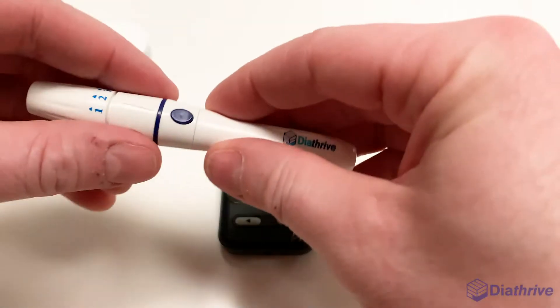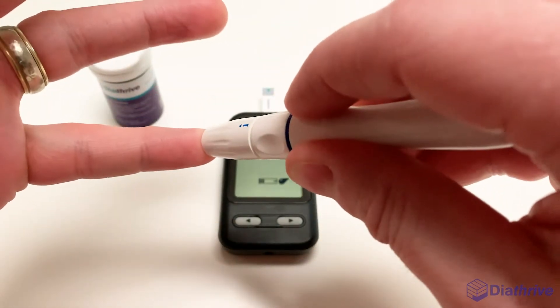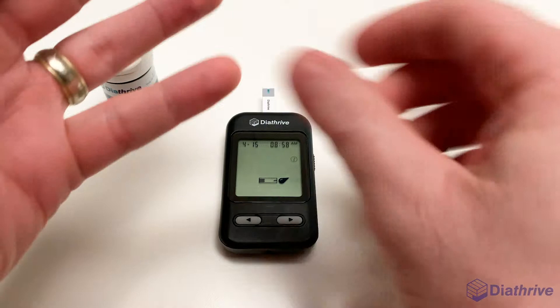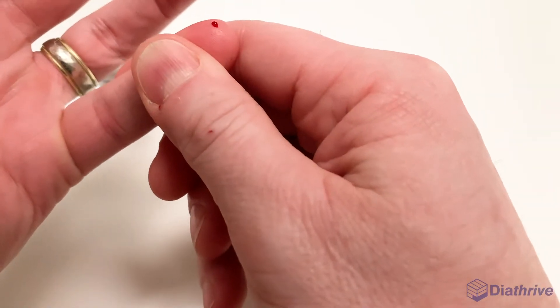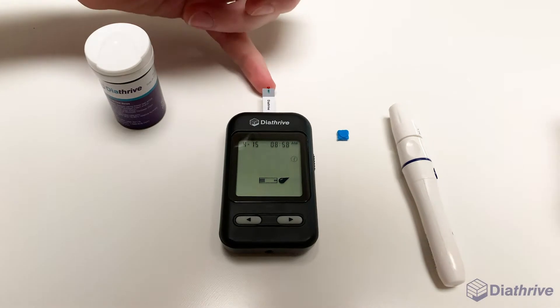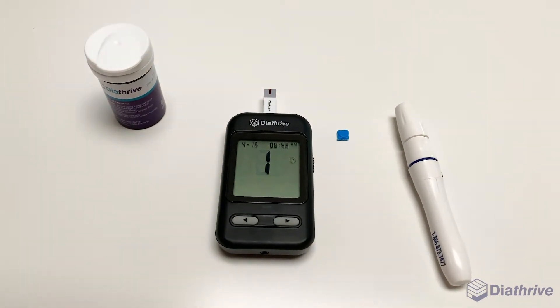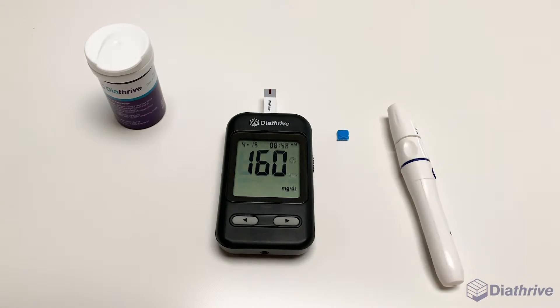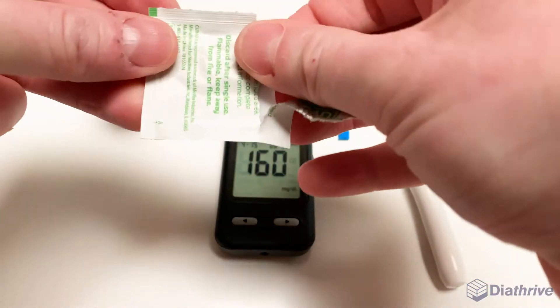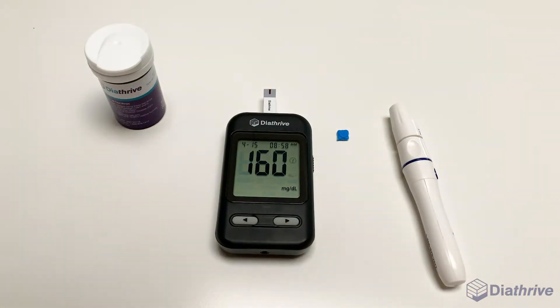Step 4: Testing your blood. Pull back on the lancing device to load it. Press the tip of the device lightly against the side of your finger near the tip and press the blue button. This will puncture your skin. Squeeze gently to draw a drop of blood and apply it to the tip of the test strip's green chamber. Make sure you apply enough to fill the strip completely. After just three seconds, you will have your result. You can use an alcohol swab to wipe the leftover blood from your finger to keep it clean and reduce the risk of infection.